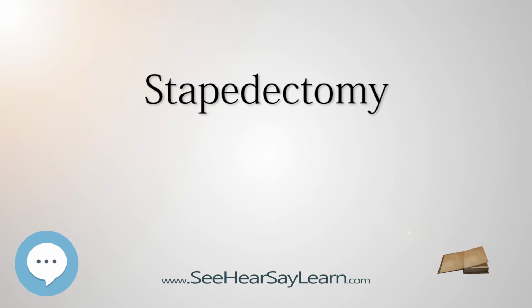Because it is a simpler and safer procedure, stapedotomy is normally preferred to stapedectomy in the absence of predictable complications. However, the success rate of either surgery depends greatly on the skill and the familiarity with the procedure of the surgeon. Furthermore, a major success factor in both surgeries is correctly determining the length of the prosthesis.